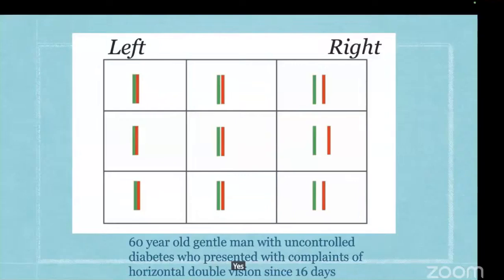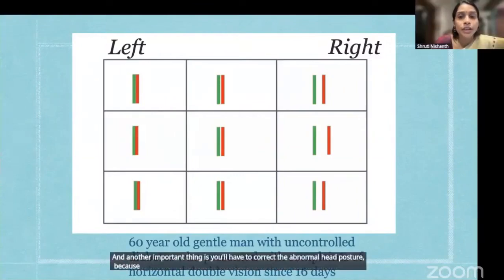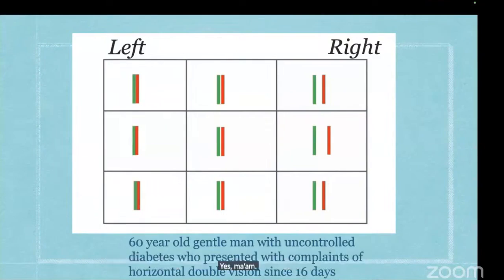Yes, ma'am. And another important thing is you'll have to correct the abnormal head posture, because if they continue to have the abnormal head posture, your findings may be different. So it's important to keep them in a forced primary position. Yes, ma'am. Okay, Ruwa. Okay, fine.